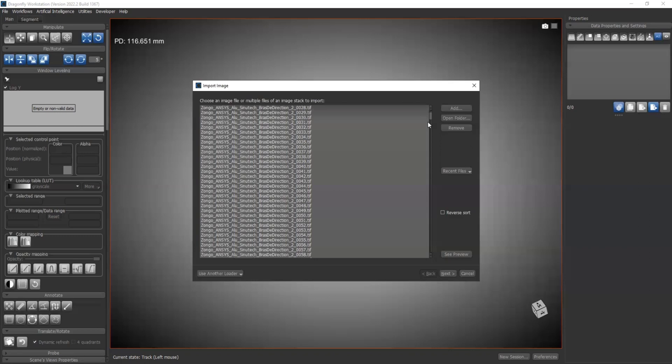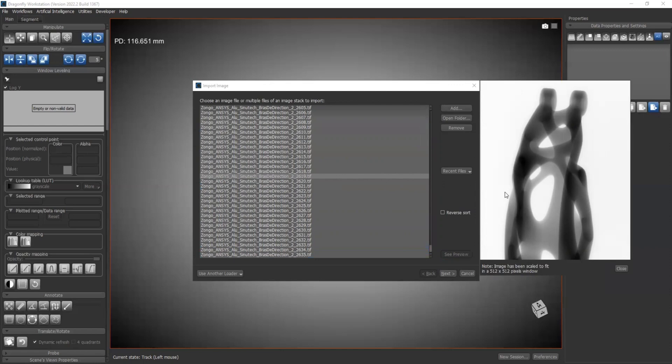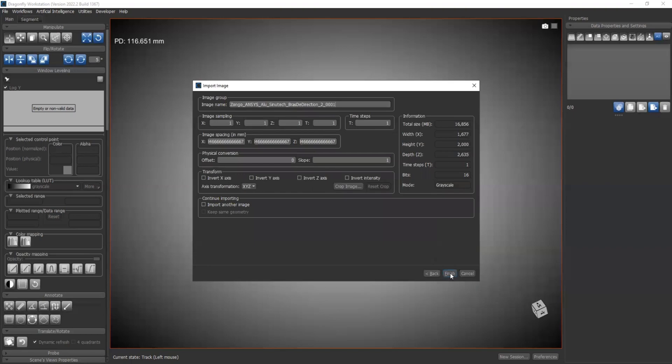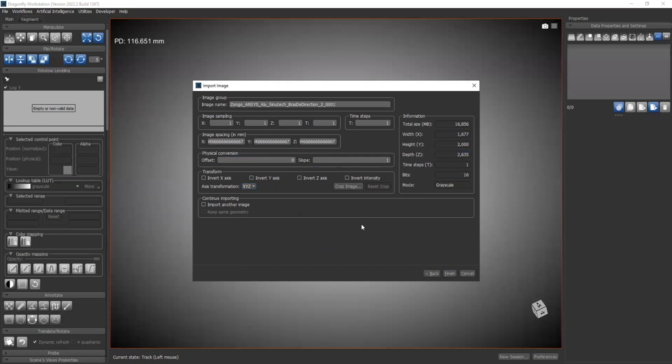Now we will have all those images loaded in the image loader. You can select one of the TIFF files, see preview, and the image will show on the right. Okay, so now we have all our images loaded. We can go to next. Image sampling, image spacing, we don't need to choose anything over here. Transform information - all the information is correct. The detectors are 1677 by 2000, and we have 2635 slices. We can go finish.